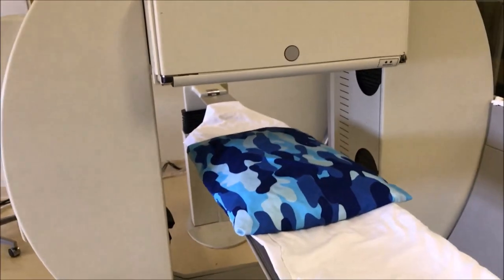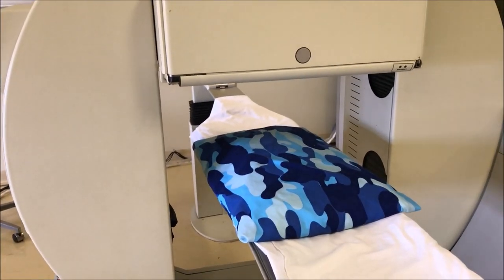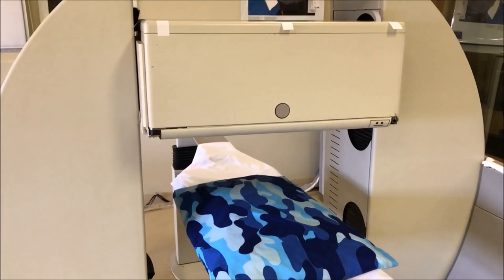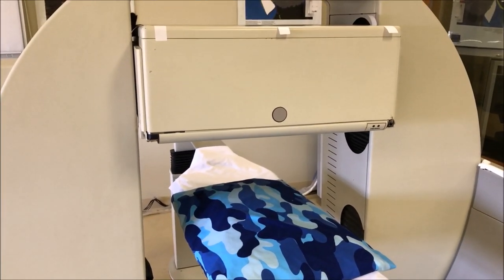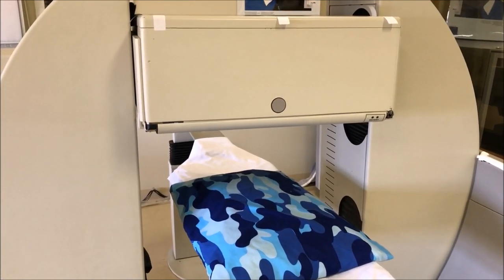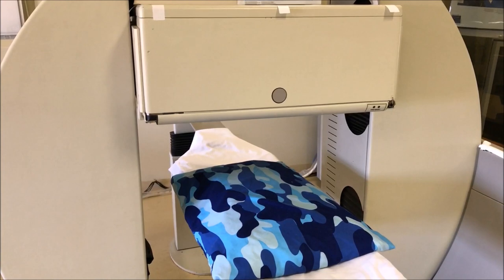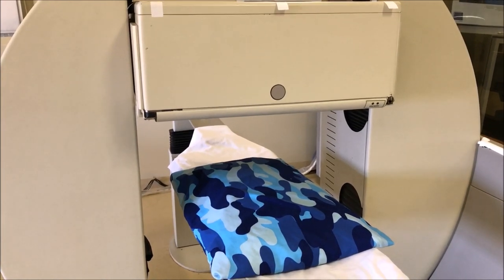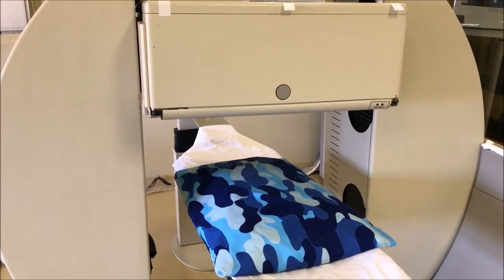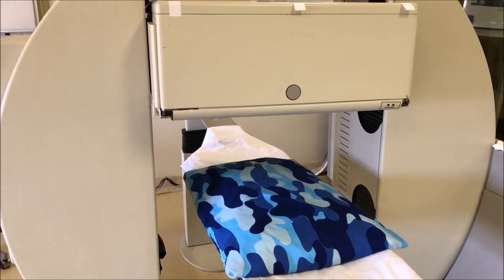The first part of the process is actually the patient. We've administered the radiopharmaceutical to the patient. It's important to keep in mind that this gamma camera is not radioactive itself — it's a radiation detector, so it doesn't emit x-rays or anything like that. We administer a radiopharmaceutical to the patient and it goes to different organs in the patient's body, and then we image it by distribution.